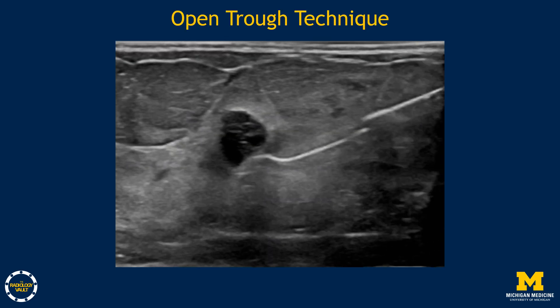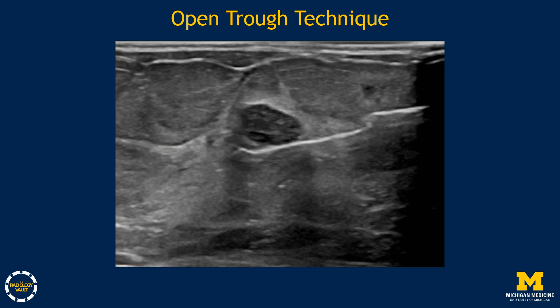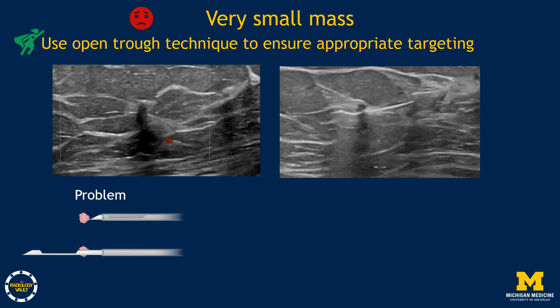Here is a video showing the open trough technique. It may take some pressure to push the needle with the trough out, as it's not as sturdy as a cocked needle. For a posterior mass along the chest wall or fatty tissues surrounding the target such as the axilla, this method typically works well. You also have the added benefit of torquing the needle to confirm you're in the mass if the mass moves with the needle. The open trough technique is also very helpful for small masses to confirm adequate sampling within the trough, though it's usually easier when surrounding tissue is fatty.